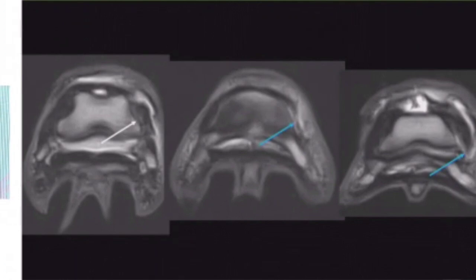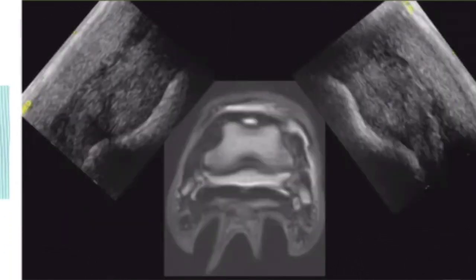So the ultrasound gave us some answer, but it didn't give us the extent and the severity of the injury. And to me then, when I scan a collateral ligament, I always, when possible, and I realize the reality of life is it's not always possible, whenever possible, I want to get an MRI, because if it looks normal on the ultrasound, it could still be abnormal in the hoof capsule. And if it looks abnormal on the ultrasound, like it did in this case, it can be much worse in the hoof capsule. So I've just flipped the ultrasound now to line up with your MRI.